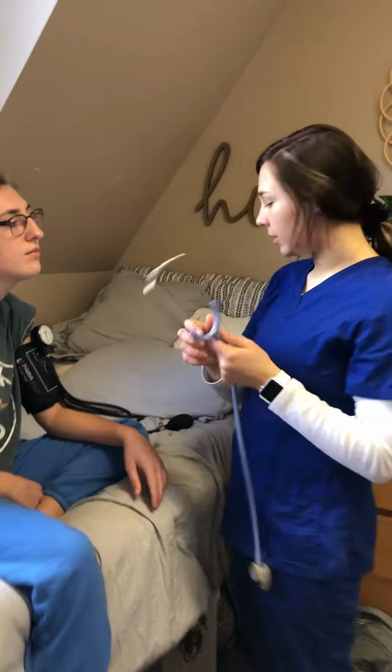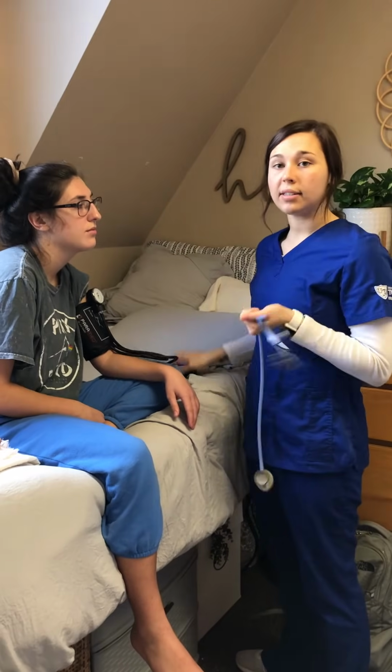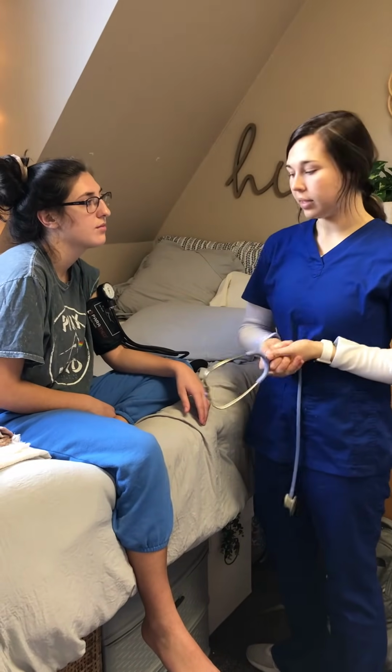Okay, so I got 118 over 62, and that falls within the normal range of 60 to 80 for diastolic and 90 to 120 for systolic.